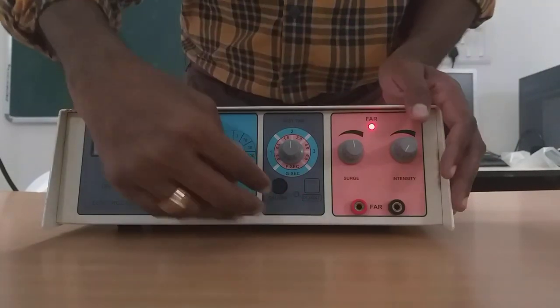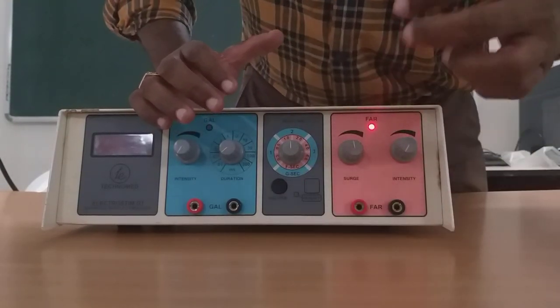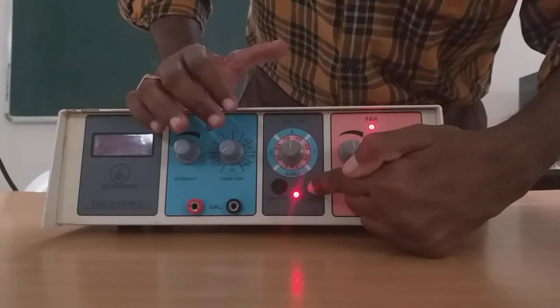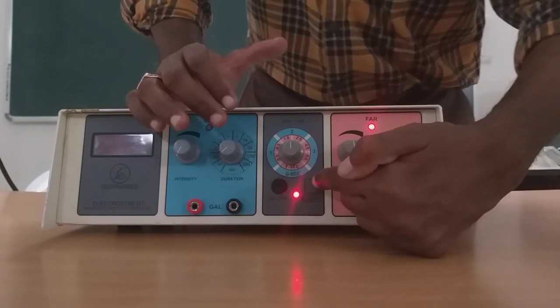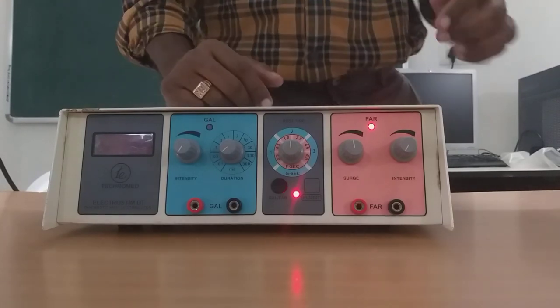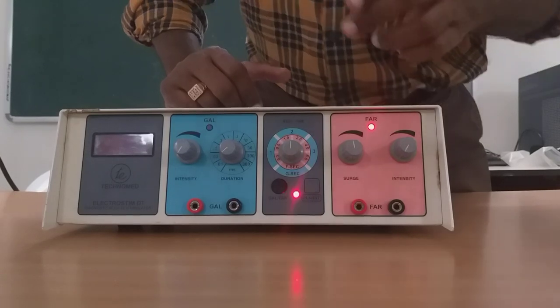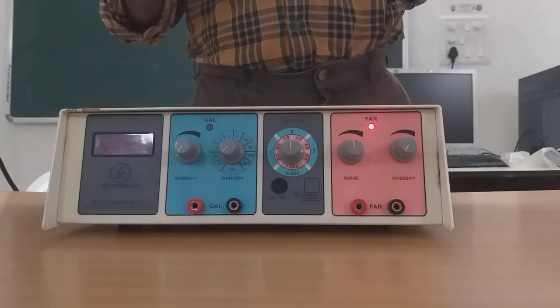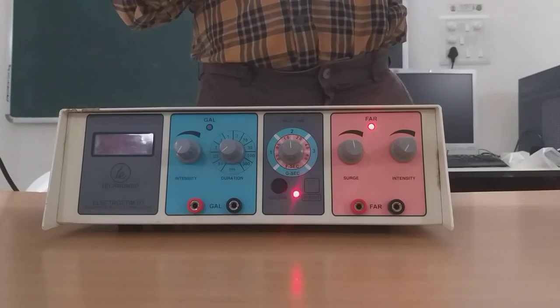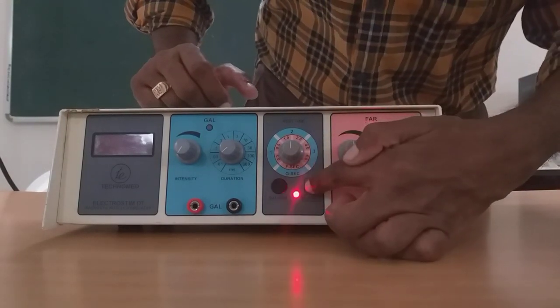Let me start with the faradic current. Faradic current can be of two types: plain faradic or surged faradic. When I switch on and there is no blinking of light, that means it is plain faradic — the current is flowing uninterrupted. Very rarely we use plain faradic for therapeutic purposes. This is actually interrupted faradic, but we surge it. Surge means each and every impulse is going to increase in intensity slowly — it is a kind of a ramp of every pulse.